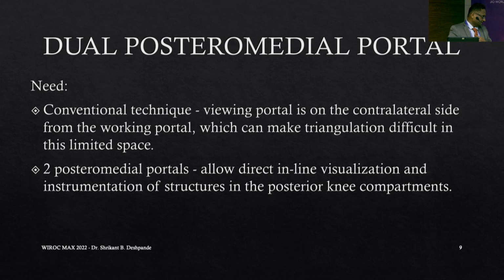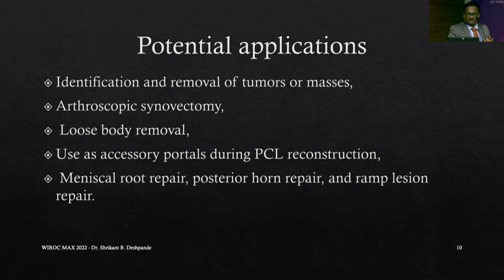The dual posteromedial portal is designed because in the conventional technique the viewing portal was on the contralateral side. That is, you are viewing from the posteromedial side and working from the lateral side, which becomes difficult, and triangulation was difficult in the limited space. And again the septum you have to cross. That's why two posteromedial portals are designed, for easier triangulation and easier instrumentation in a relatively bigger posteromedial compartment. Potential applications of the dual posteromedial portal are identification and removal of masses, arthroscopic synovectomy, loose body removal, use of accessory portals during PCL reconstruction, meniscal root repair and posterior horn repair, and ramp lesion repairs.